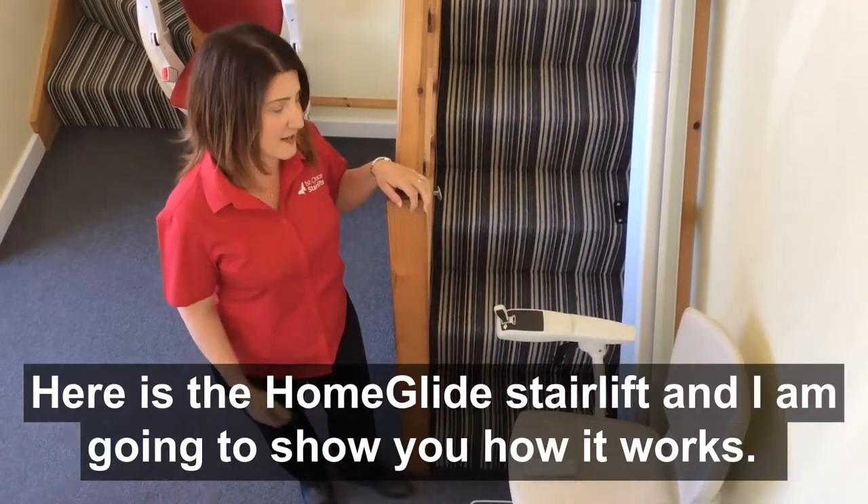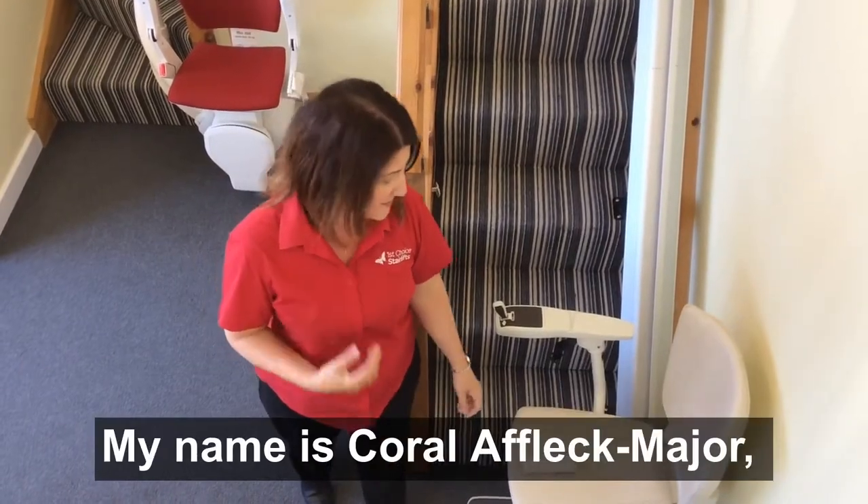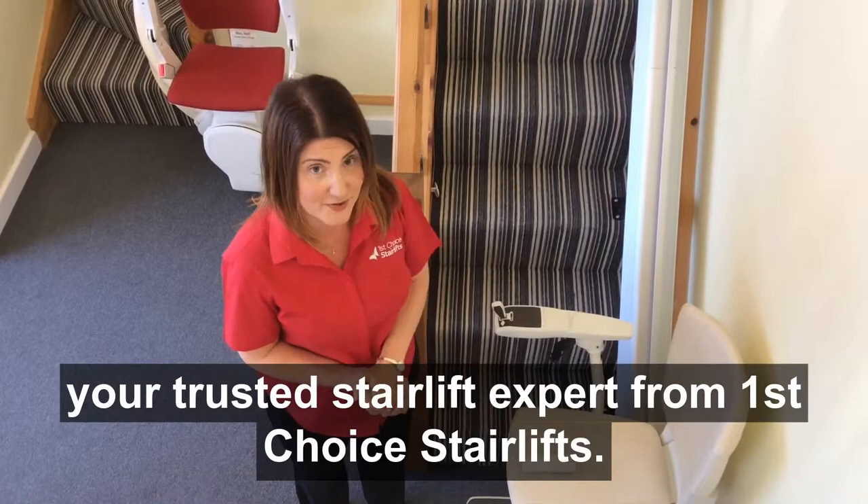Ever wondered how a stairlift works? Here is the HomeGlide stairlift and I am going to show you how it works. My name is Coral Affleck Major, your trusted stairlift expert from First Choice Stairlifts.